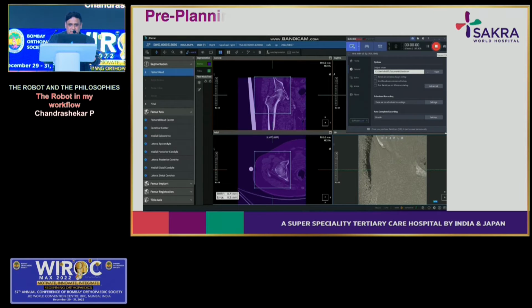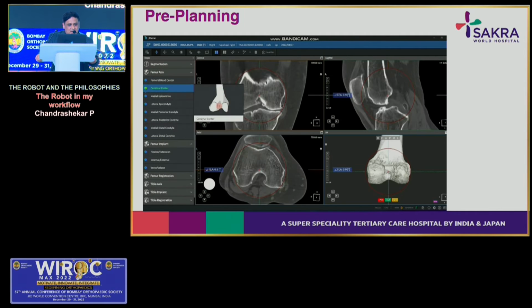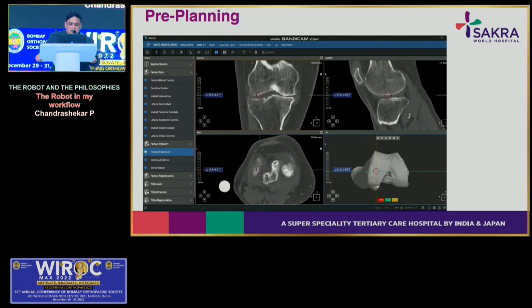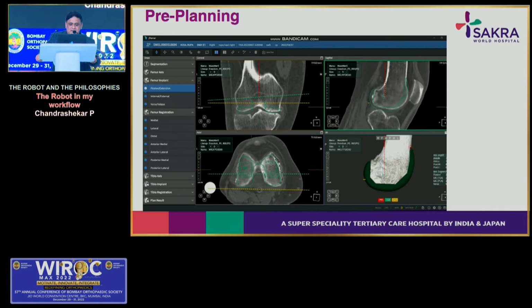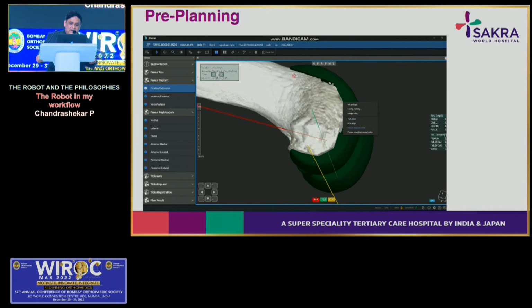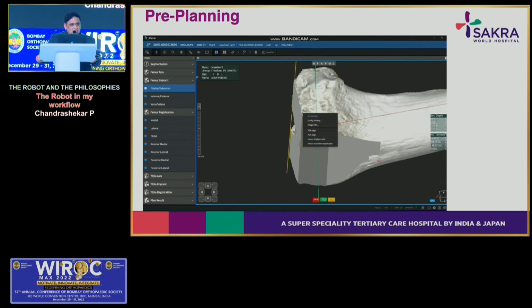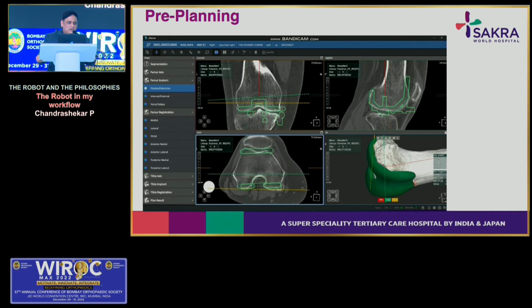So this is the preoperative CT scan, where first the CT is made from hip, knee, ankle, and then we measure some points on the hip center, the femur, and the tibia, and mark the transepicondylar axis and posterior condylar axis. Then we see prospectively how the implant sits, both on the posteromedial condyle and posterolateral condyle. We also see how the implant fits mediolaterally, distally, and anteriorly. So we all agree that there are some knees which are ML bigger and AP smaller, and some knees which are AP bigger and ML smaller. So the CT gives all the benefits, like you can manipulate your implant depending on what is best suited for you.